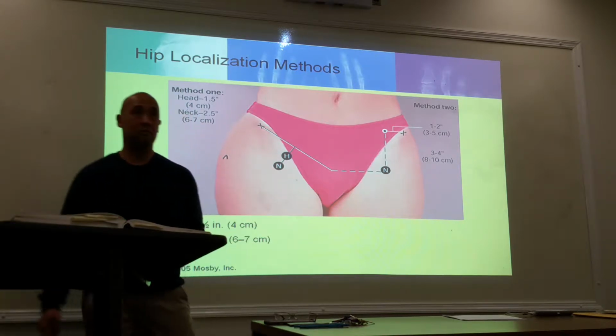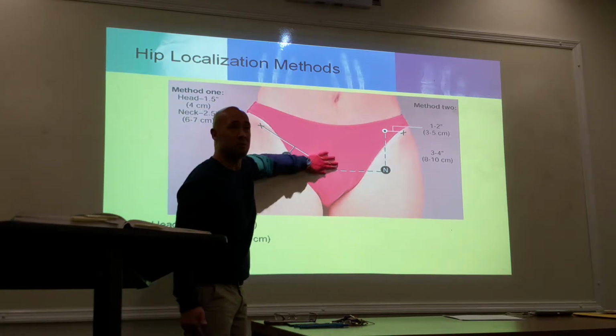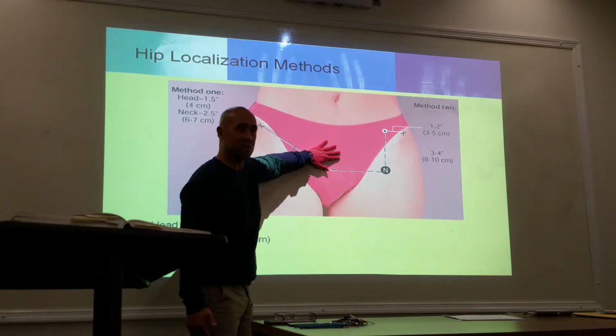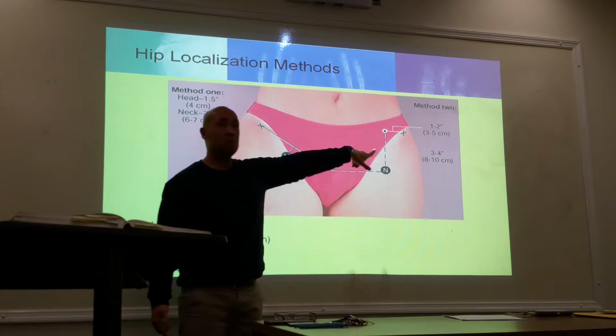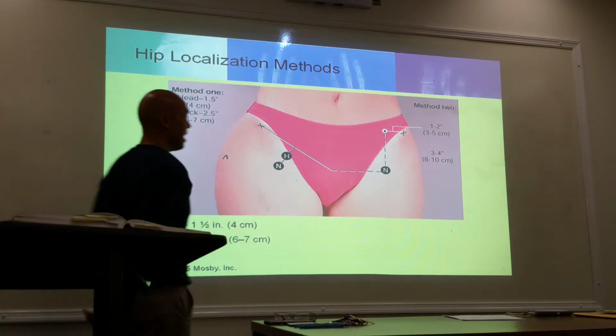That's method one. Now remember what I said. Am I going to be putting my hands on there? So we want to avoid touching the symphysis pubis as much as possible. So method two is a little bit more appropriate in finding the head and the neck.